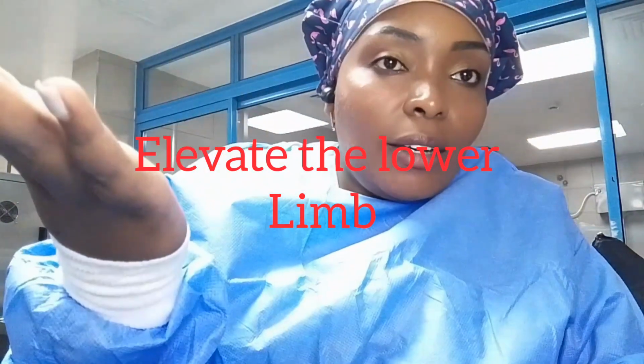The first thing you have to do is to position your patient. Assume your patient is lying on the bed in a straight position, facing upward, in the supine position. You elevate the foot side a little, ensuring it's a bit higher than the side of the head.